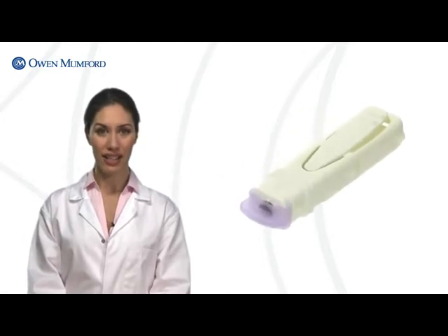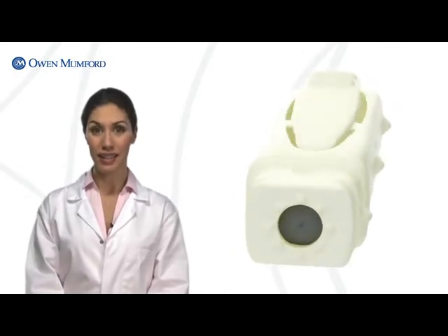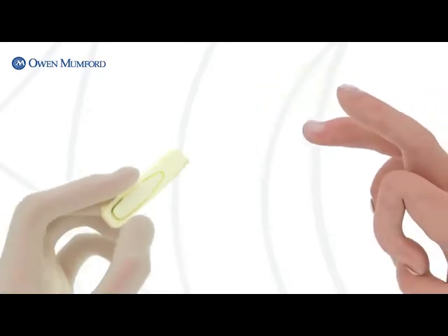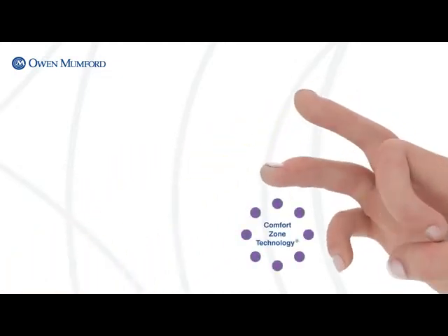Unistik3 safety lancets are designed to maximise patient comfort while offering a consistent level of safety for the healthcare professional. The secret to virtually pain-free sampling is in the unique patented design. The patient end of the device features comfort zone technology — a series of eight raised dots that stimulate nerve endings when pressed against the sample site. These raised dots send a message of comfort to the brain, masking the weaker stimulus of the lancet as it punctures the skin.